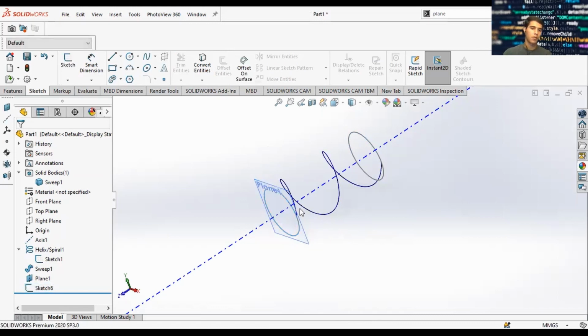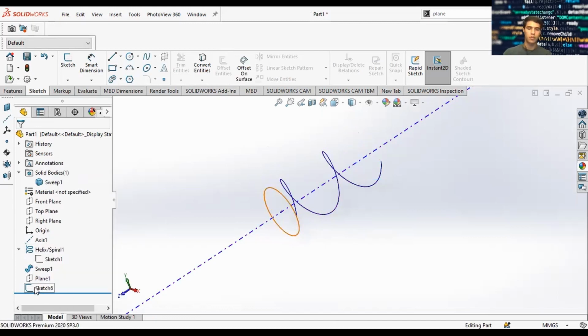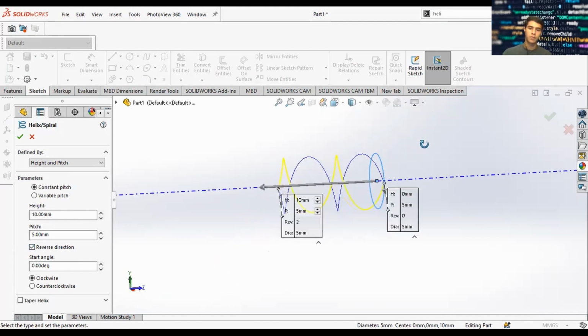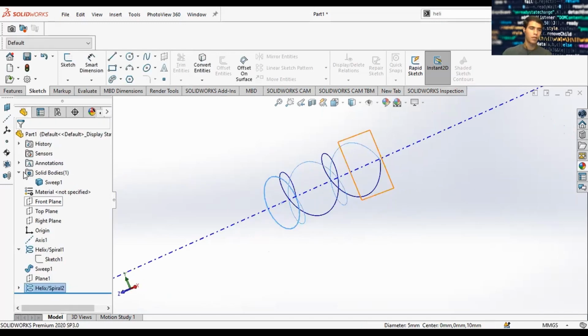Sounds good. Now we have our plane. We're going to hide the plane. We're going to hide the circle for sketch 1. And we're going to keep our circle for sketch 6. So now we do a helix. There's a helix. Our height is 10. Our pitch is 5. We're going to go in the opposite direction. And there we have our helix.